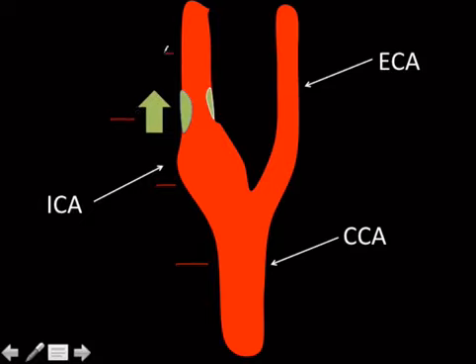And then you measure it here, you might get a dampening of the waveform. That's the general idea. And somebody along the line has done a paper that said that a certain velocity increase is equal to a certain degree of stenosis, and that is a testable number. And if you've done a bunch of these, you probably have it memorized.